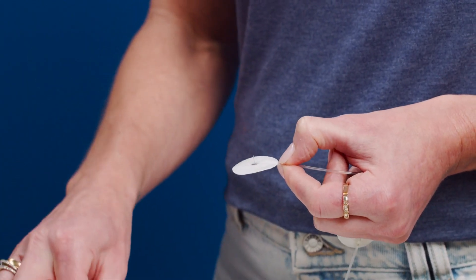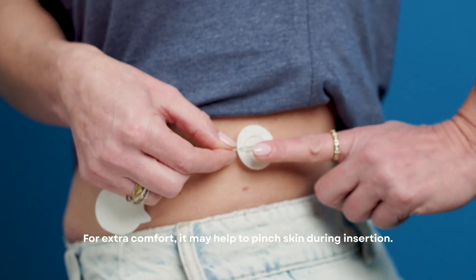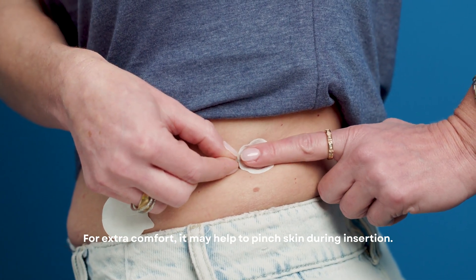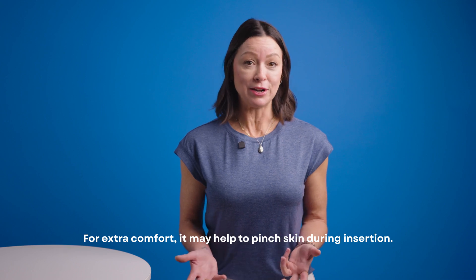Now, let's go step by step through the insertion process. Start by gently twisting and pulling off the needle guard. Hold the tubing near the infusion set and insert the TruSteel needle straight into your skin. Depending on your body type, you might find it helpful to pinch your skin before inserting.